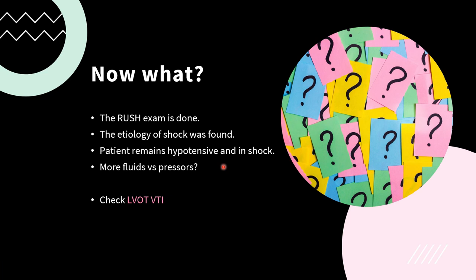The next step would be to check the patient's LVOT VTI to determine fluid responsiveness. This concept was described by Dr. Blanco in 2015 as the RUSH VTI protocol.